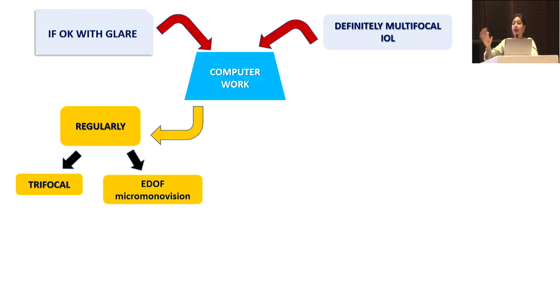You cannot think of using a traditional bifocal for this patient. You have to address it, otherwise he's going to be extremely unhappy. So a first choice would be a trifocal or an EDOF with a micromonovision. If he also wants good near vision, then trifocal is important.